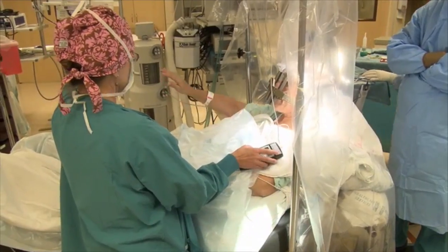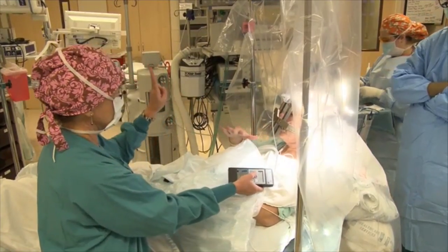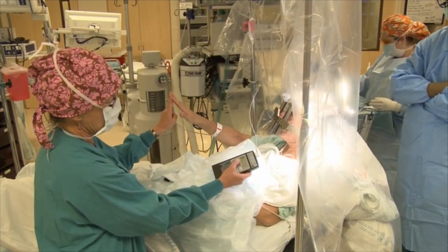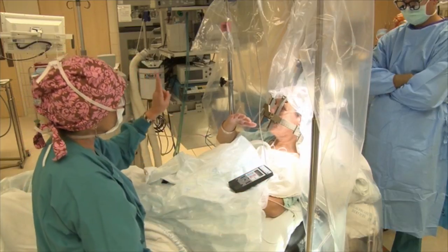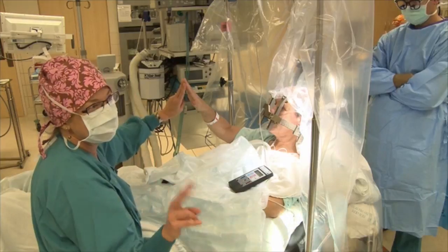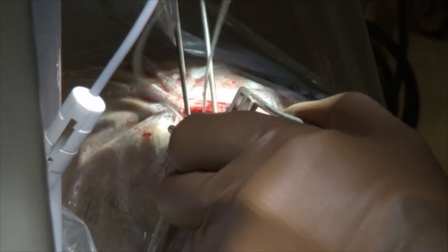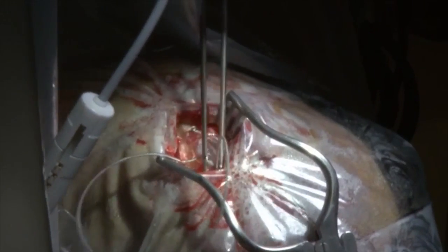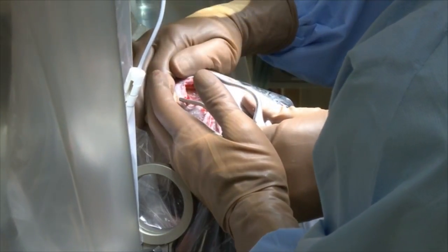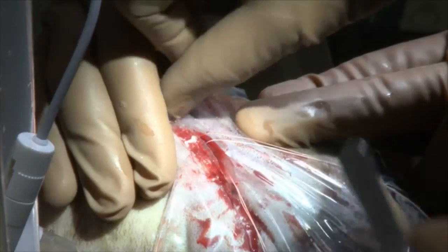We're asking Vicki to perform actions that will let us know how well the stimulation is working. We take patients through the entire range of possibilities we'd do as an outpatient, all within 10 or 15 minutes in the operating room. We routinely stimulate at levels significantly higher than we'd ever anticipate using once the procedure is complete. Once that electrode is in position, it's time to get the patient comfortable. We're washing everything with saline solution containing antibiotics to ward off infection and starting to put stitches in the skin.